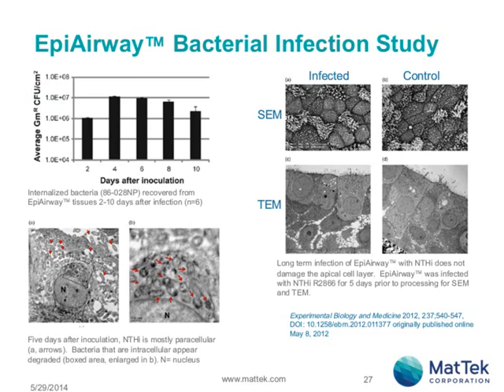So under normal conditions, non-typable Haemophilus influenzae, or NTHI, is a commensal bacteria that becomes pathogenic at opportunistic times. So therefore, the study of how this bacteria interacts with respiratory epithelial cells is especially of interest. The graph on the top left here shows recovery of the NTHI from the co-culture of EpiAirway for up to 10 days post-inoculation. So you can see that even after 10 days, the bacteria are still maintained within the EpiAirway culture and can be recovered.